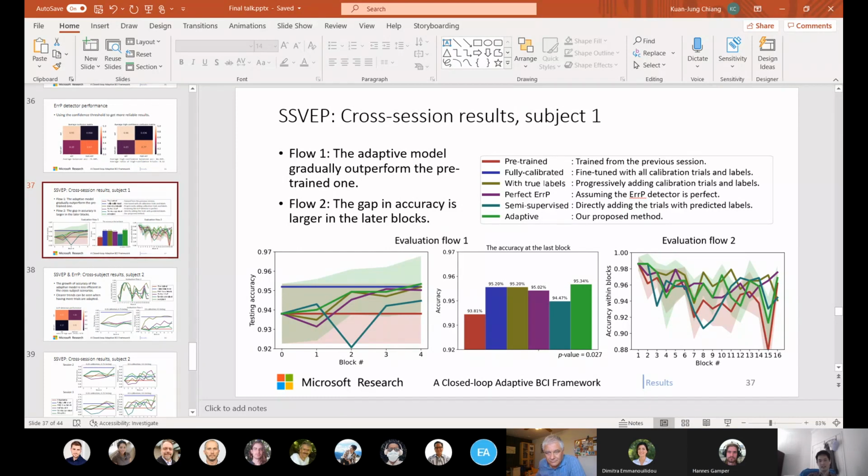Yeah, but Hannes, this is exactly the variability we would like to address with this project, because let's say you target a device for BCI for the general population, you cannot guarantee that everybody will put the device on exactly the same way, with medical precision, as an experienced technician will. So that's actually a good thing.